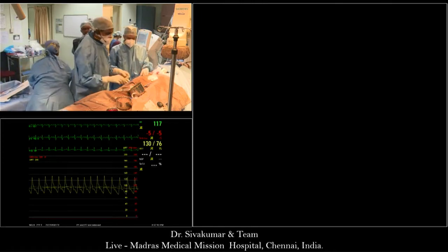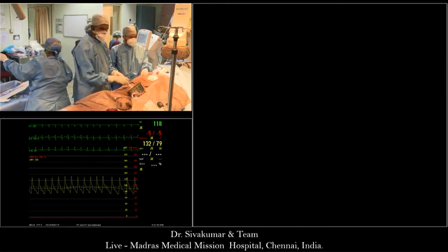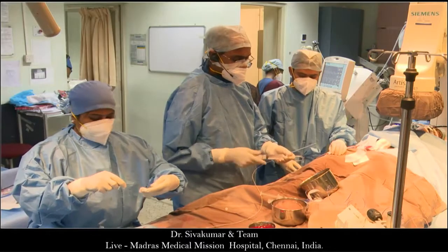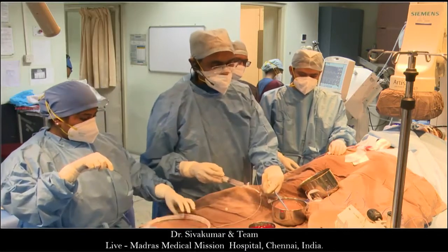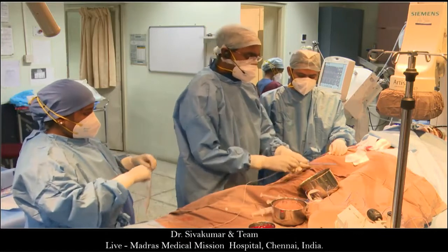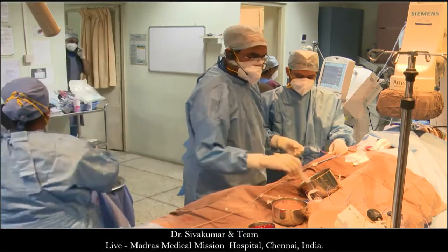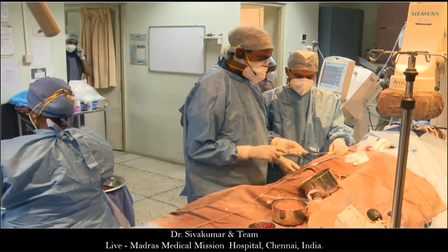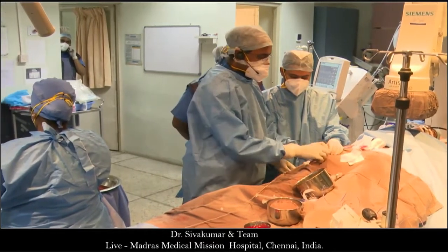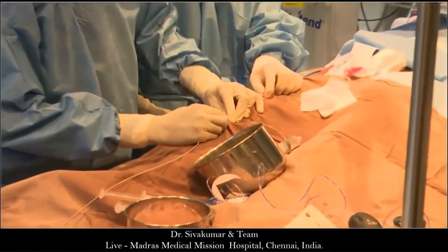There wasn't a question. We're just asking, are you in the same pulmonary vein as you were before? No, it is in the lower pulmonary vein. I have gone into the lower. Actually, because of my repeated sheath manipulations, the Cook-Mullins sheath got a little bit kinked, so I had to change to another 14 French sheath. Let me just say you're doing a fantastic job there. We're learning lots.